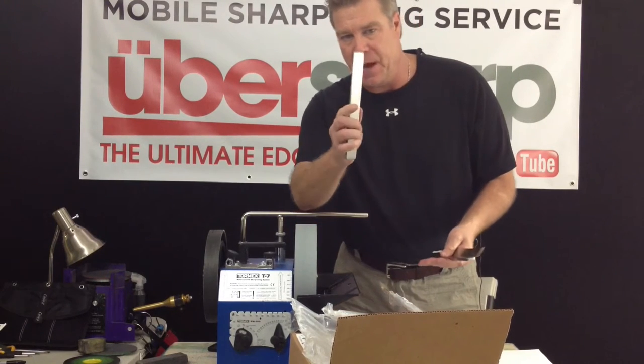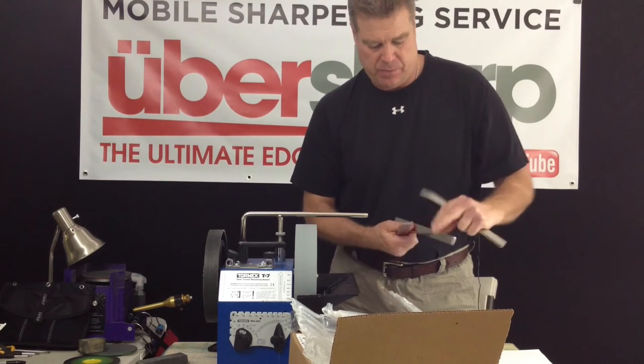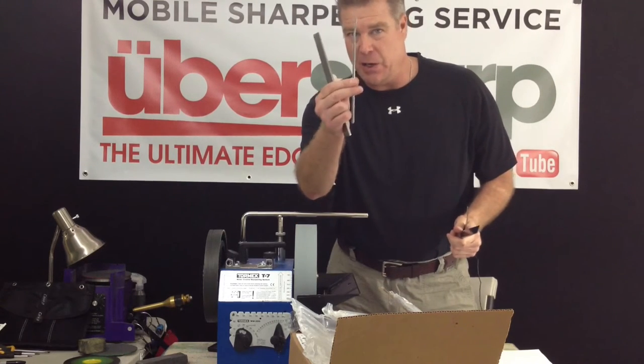They come in different sizes: wide straight, wide curved, medium-wide straight, skinny curved.